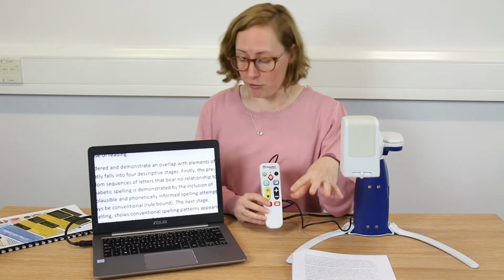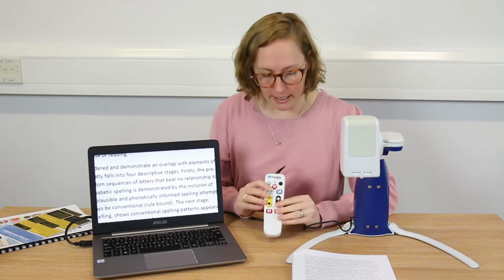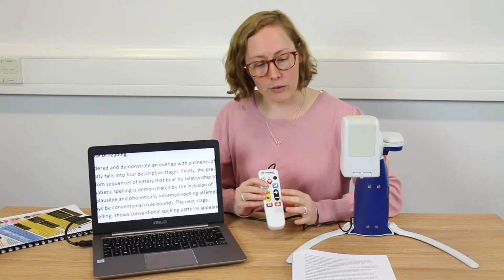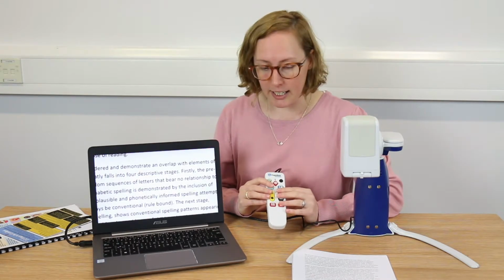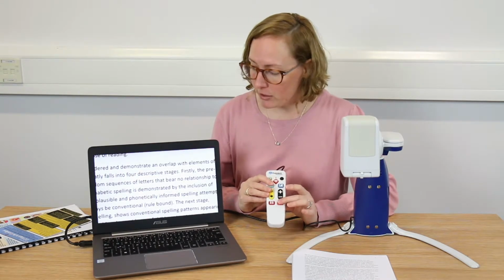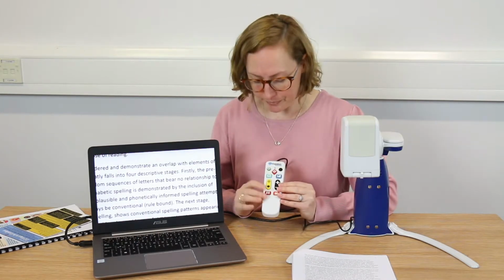We also have a focus freeze button, and what that means is this camera is always going to focus on whatever's closest to it, which is great if you just want to read things. But if you are using your hand underneath, it's going to try and focus on the top of your hand. So if you're a student that's doing some manual work, or if you're a student that's writing, you will want to freeze the focus so that it is no longer trying to focus on the top of your hand, but just remains focused on the page and whatever it is that you're doing.